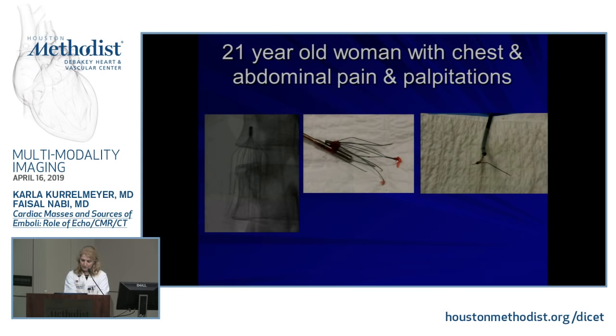The reason we had to remove the filter wasn't just because she had abdominal pain, but one of the legs is missing, so then all the other legs become loose. And they also had a high likelihood of migrating over the next few months. So we removed it the usual way that they recommend. And after that, the fractured strut that was lodged in the heart, we removed using a bronchoscopy forceps, and snared it.